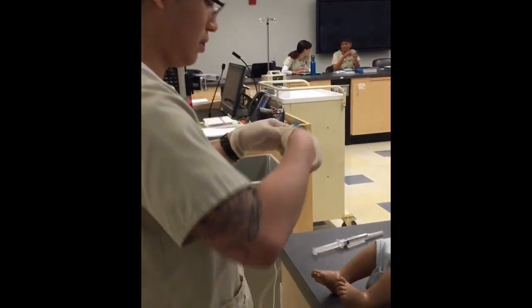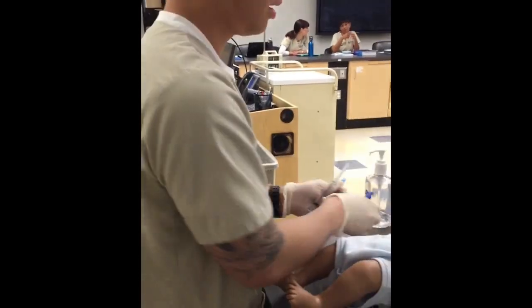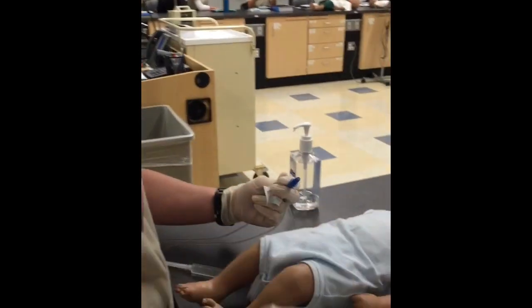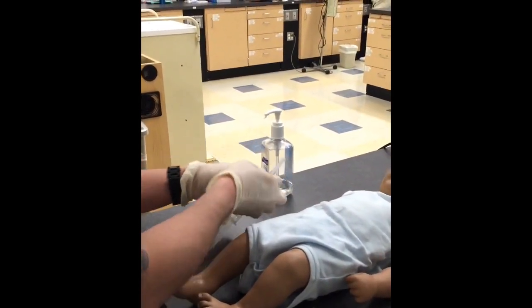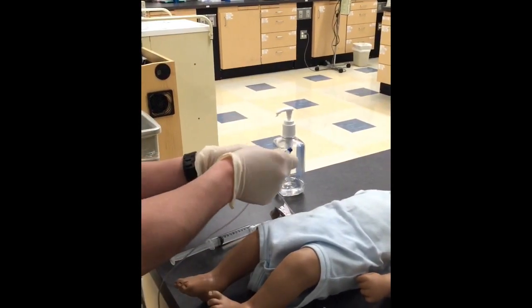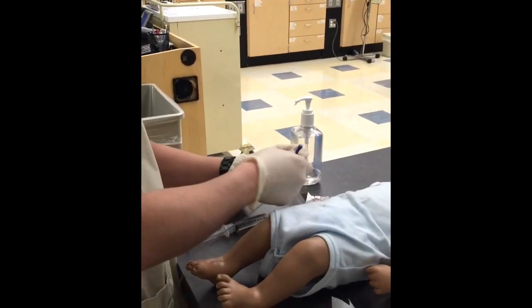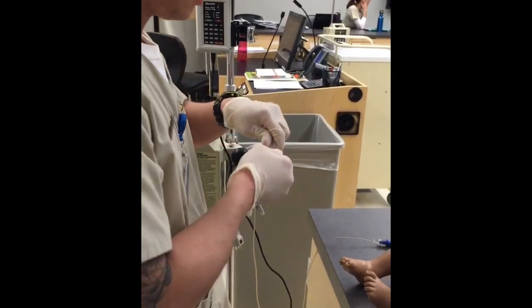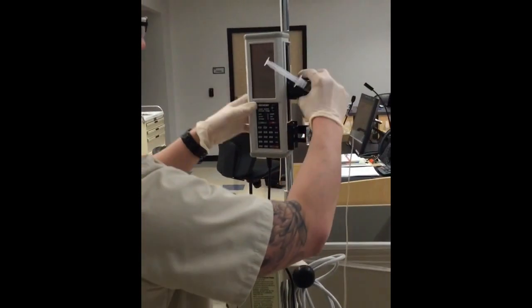Now you can throw this in a sharps container. And now you can go ahead — since you were doing that, you can clean this also. Just make sure your pump is clean so that everything is sterile. Now it's clean. Now you can connect this here.